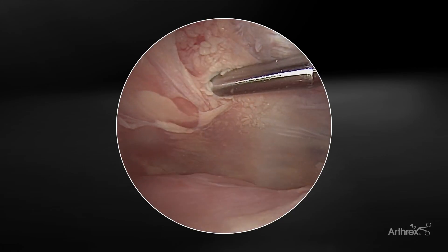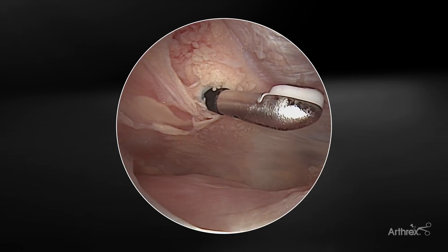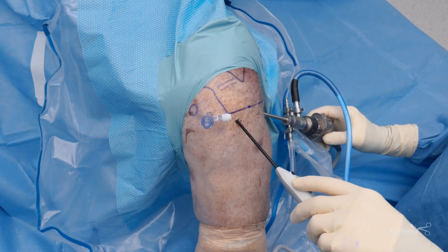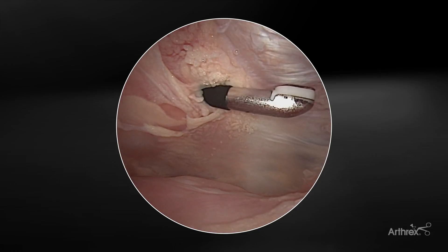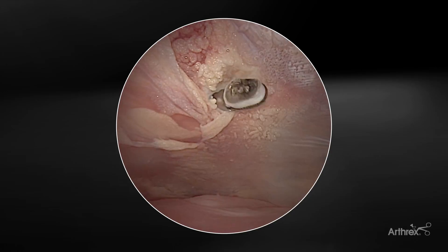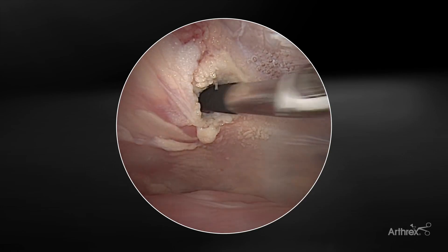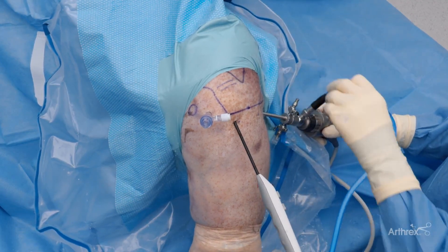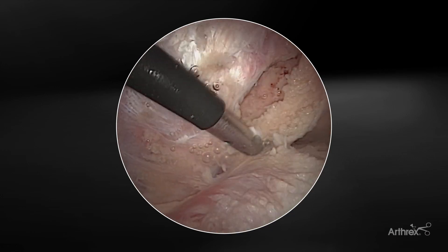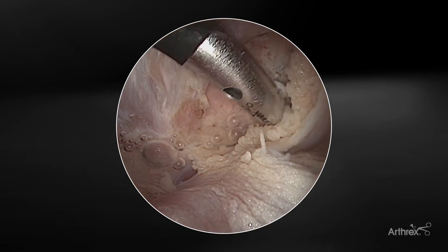We've moved up to the subacromial space, with a lateral portal. We're going to put our i90 in there. You can see how easily that slides in with the torpedo-shaped electrode — does not catch up on the tissue. When I start my subacromial decompressions, I always start with the RF. It does a really good job of resecting tissue. I'll oftentimes create a little bit of a window in the deltoid fascia, which allows for ease of insertion of other instruments if I'm going to be passing sutures through the rotator cuff. As we look medially, we can see some adipose on the undersurface of the acromion. As we're doing our decompression and prep for a rotator cuff repair, you can see how efficient the i90 is at resecting and removing the tissue.